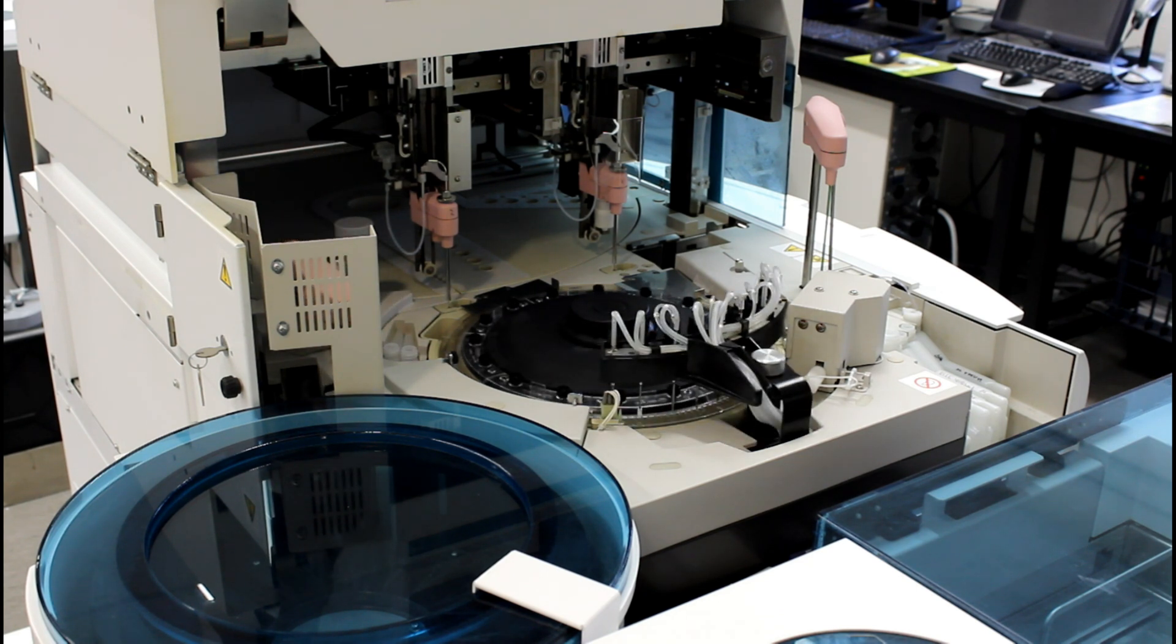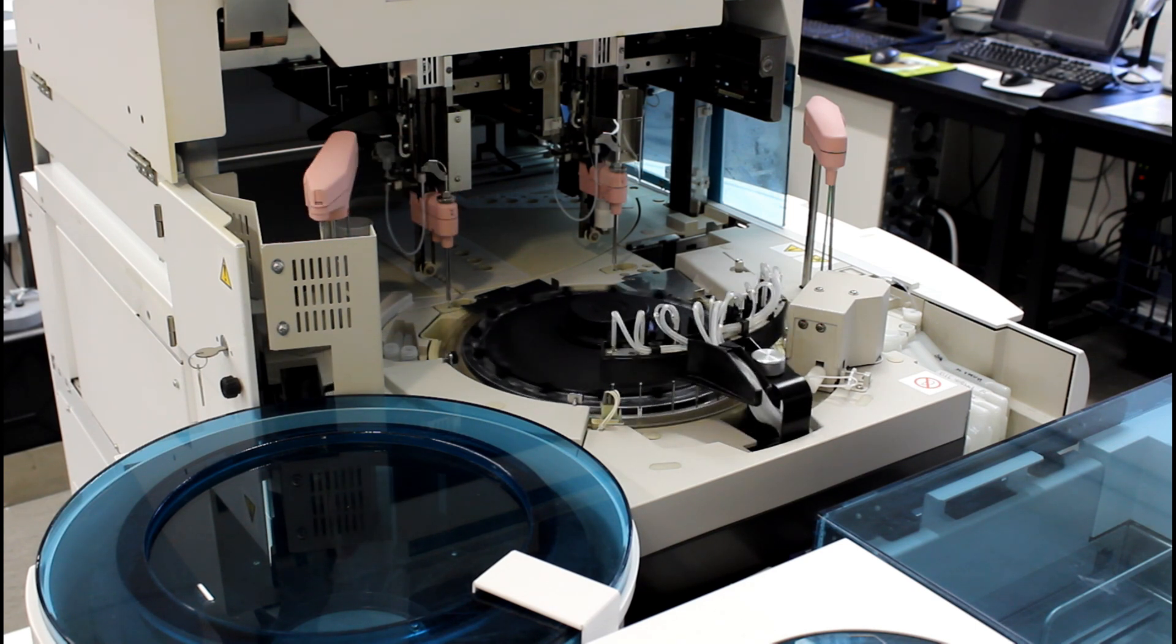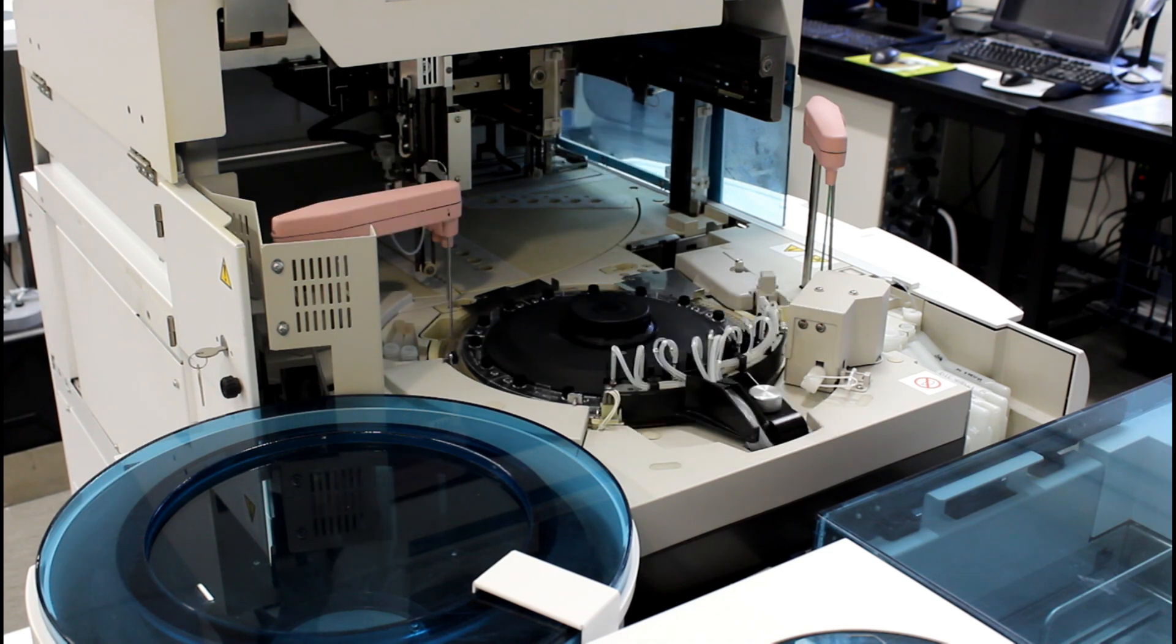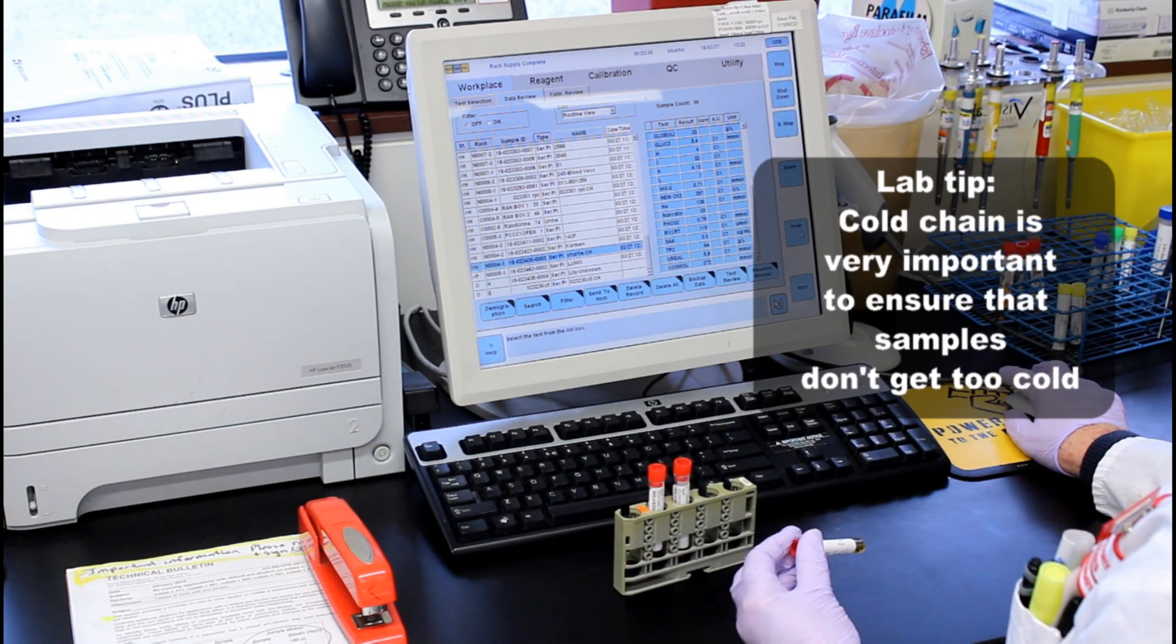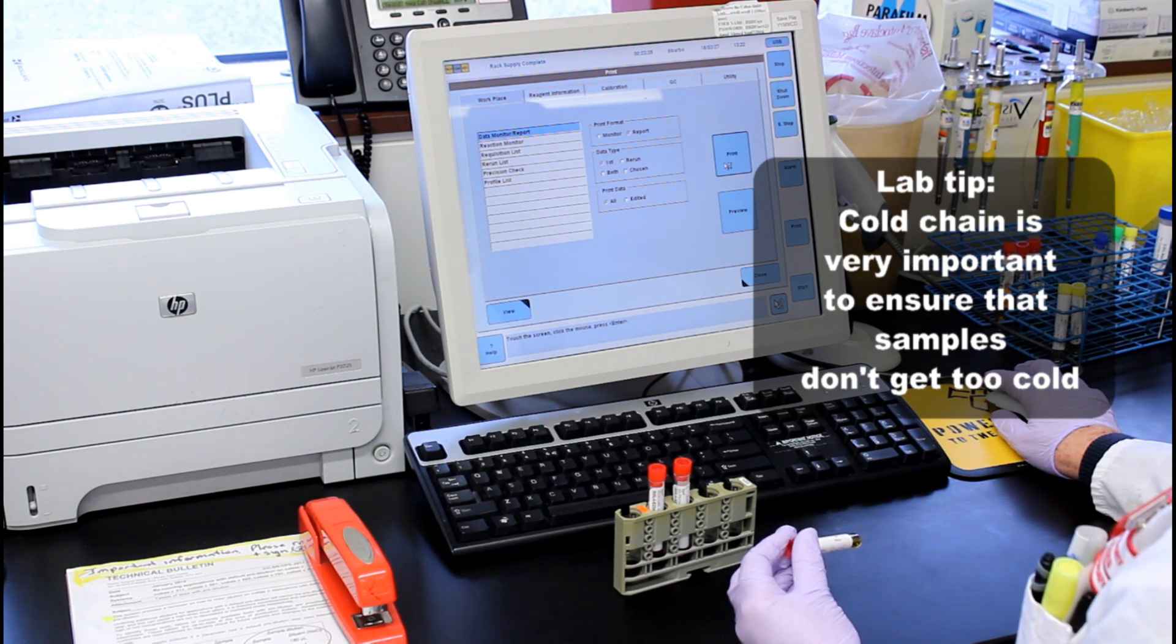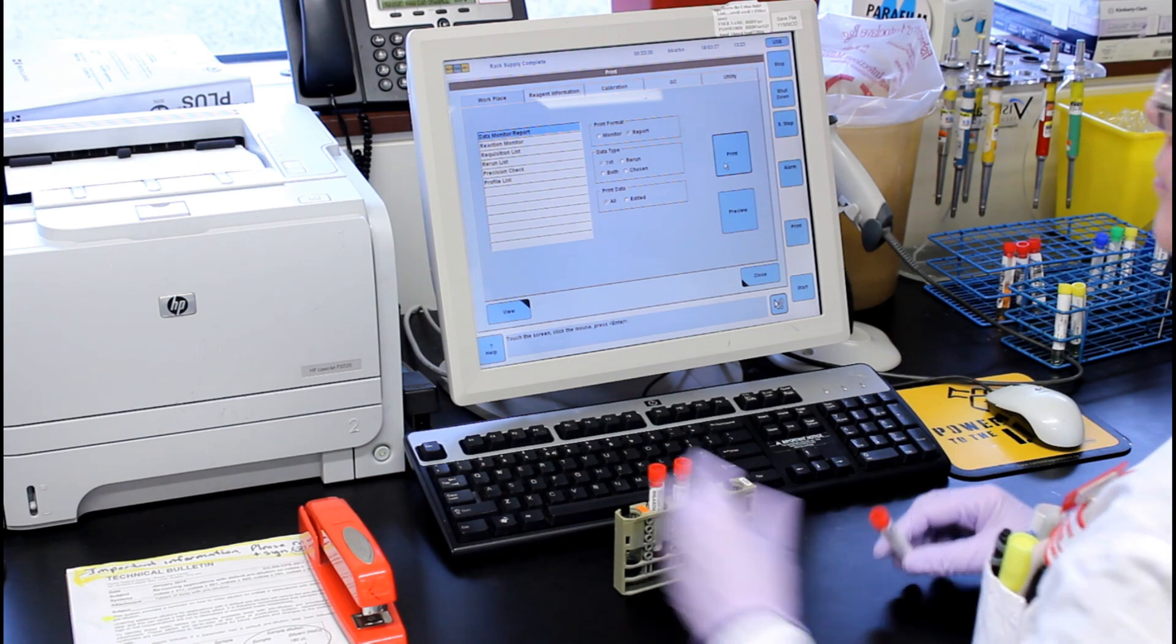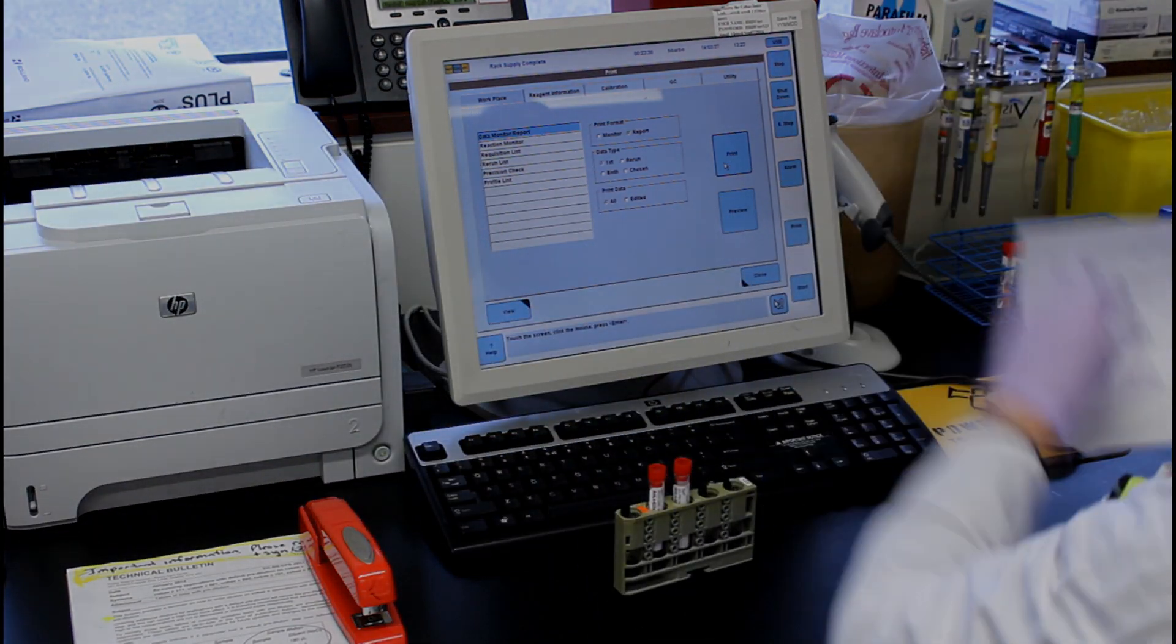This is our biochemistry machine which we can do a large number of samples in a short amount of time. It looks a lot differently than a small in-clinic machine but does the same job. An additional tip to note is that the cold chain is really important as well to make sure that things don't get too cold or too hot. Samples right next to a freezer pack can lead to hemolysis of EDTA blood. Wrap them separately when placing them near freezer packs.